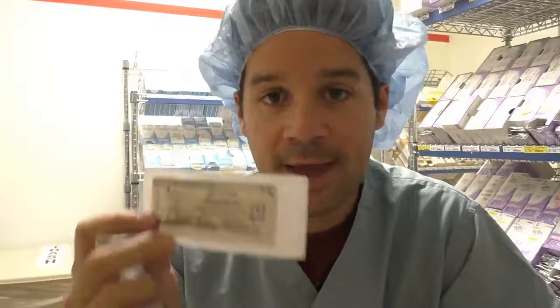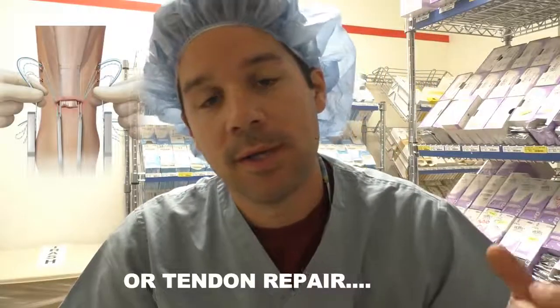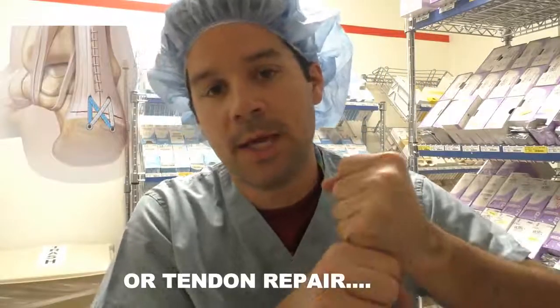Fourth and last multifilament suture I have for you here is the fiber wire. This is specifically and only used in orthopedic surgeries. Possibly podiatry, I don't know. I don't really do a lot of podiatry, so I can't say for that. But I've seen it used in orthopedic surgeries, and it's a very, very heavy suture that's used for like a ligament repair type work to keep those bones together.